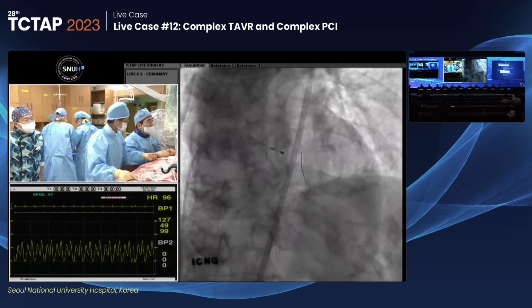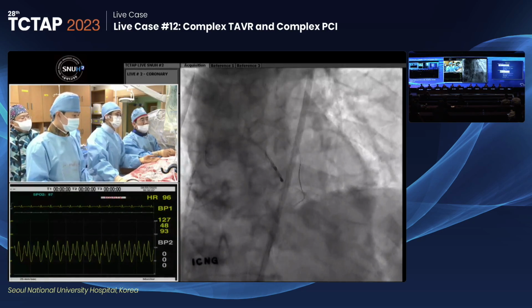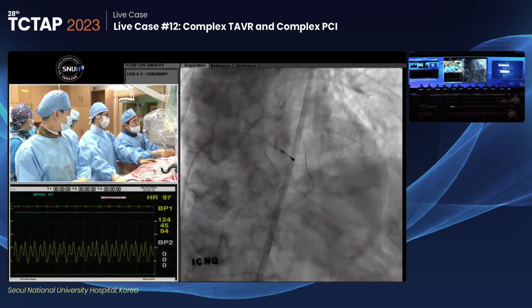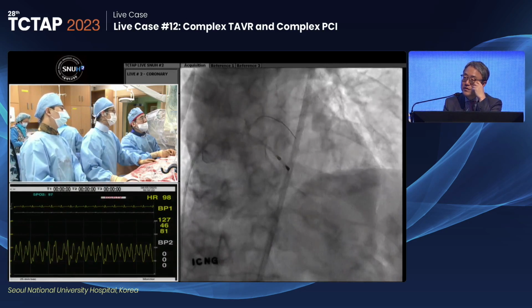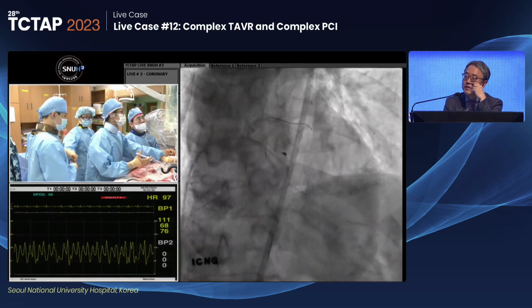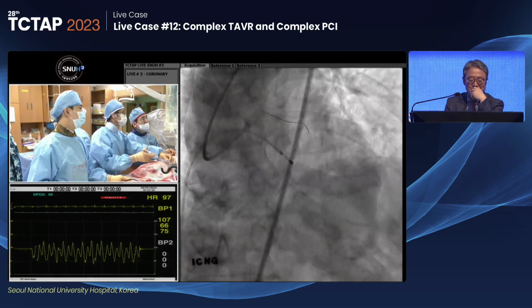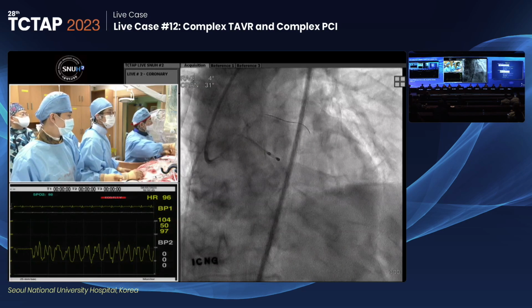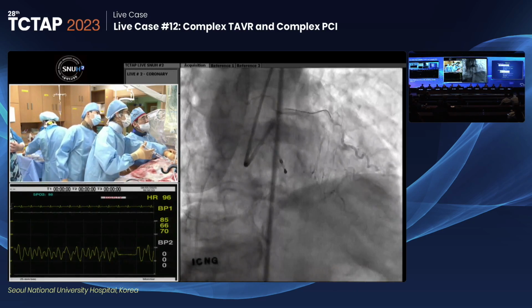Antonio, do you have the new Rotawire in Milan? Primarily we don't have it. But if this wire doesn't go down, it used to go down well. Antonio, sometimes when we try to pass the Rotawire, it does not pass. How can you do at that moment? As I said, I advance a micro balloon as much as I can and keep on advancing and dilating, and then I try with the microcatheter and go as distal as I can. You have to overcome that stenosis, because if this wire doesn't go, the other will not go. Terrible. But I will change the wire.